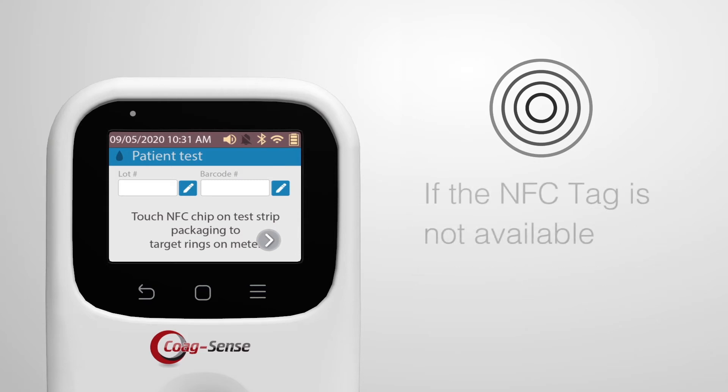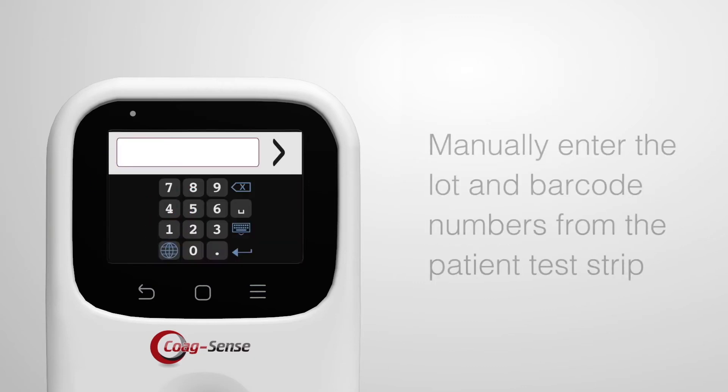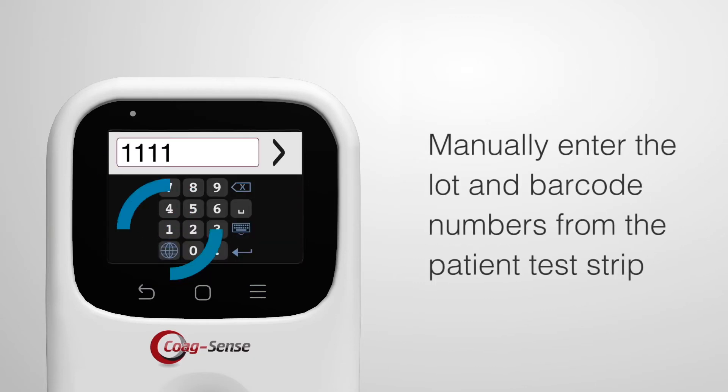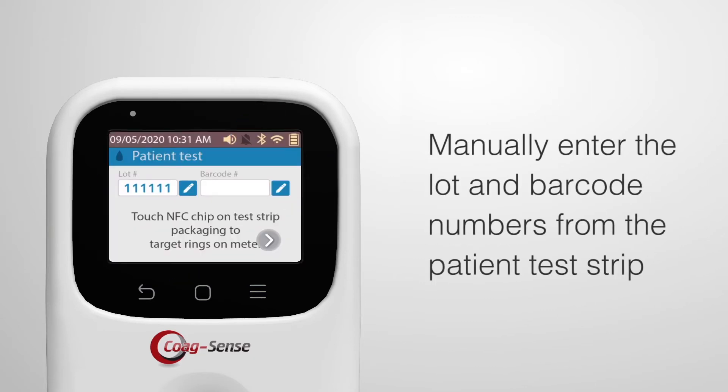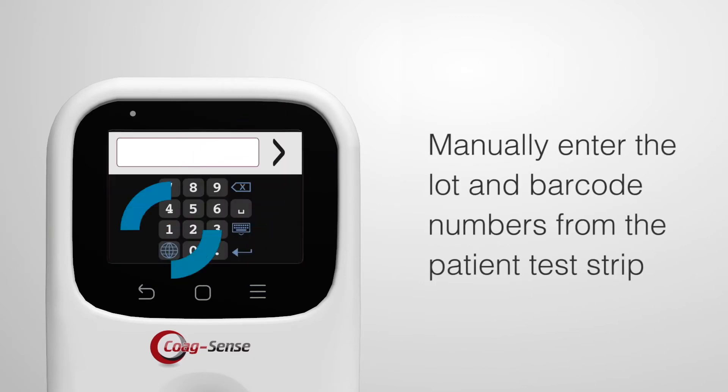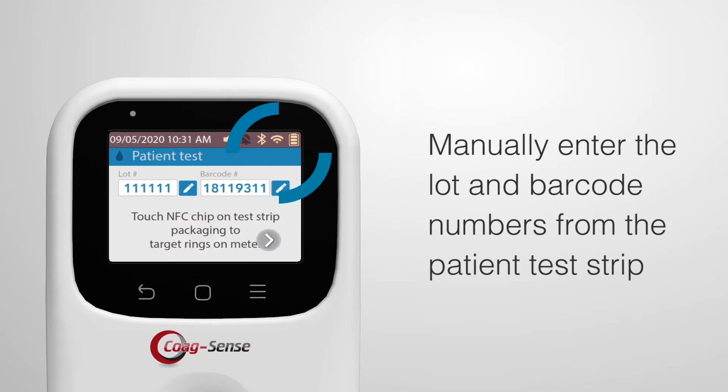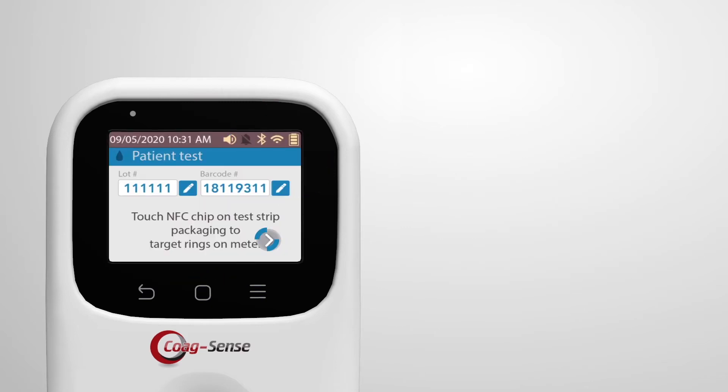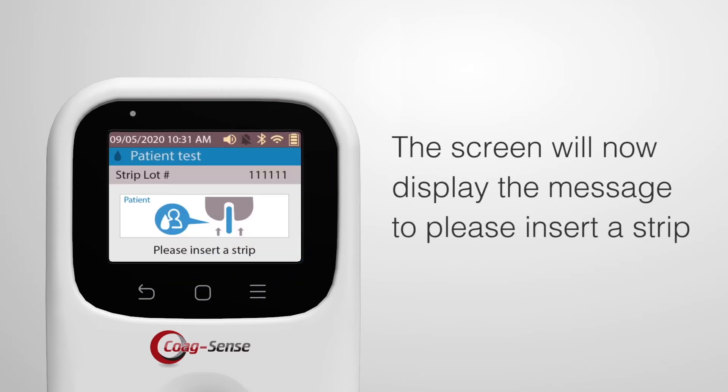If the NFC tag is not available, then manually enter the lot and barcode numbers from the patient test strip, then press the forward arrow button. The screen will now display the message to please insert a strip.